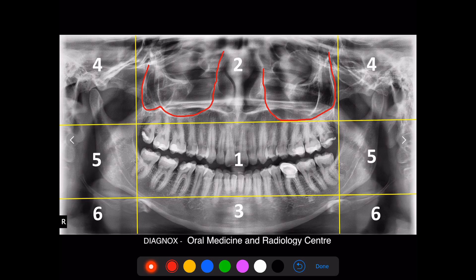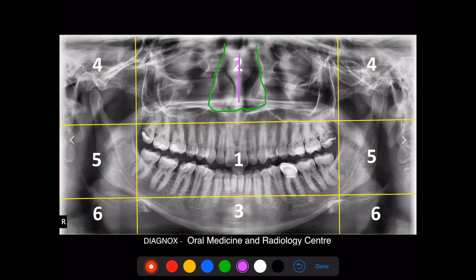Once you note down the findings within the maxillary sinus, always check for the nasal cavity which lies medial to the maxillary sinus. As you can see here, this is the outline of the nasal cavity. Within the nasal cavity, check for the medial nasal septum. In some cases, you can see the medial nasal septum being deviated towards one side, whereas in this case it appears to be straight without any obvious deviation.